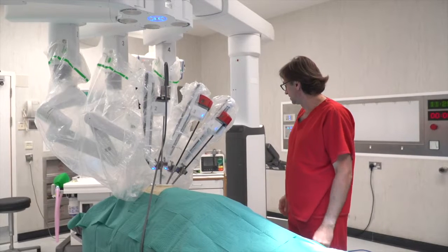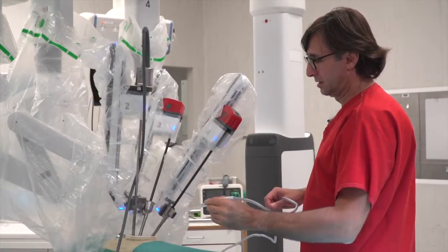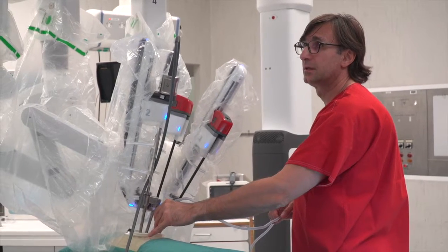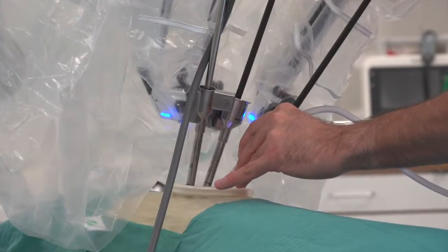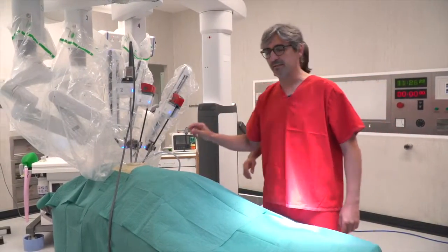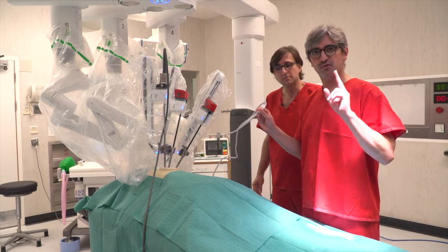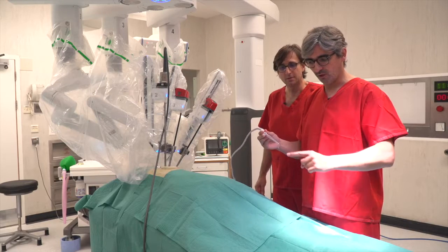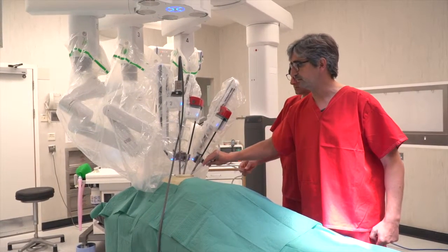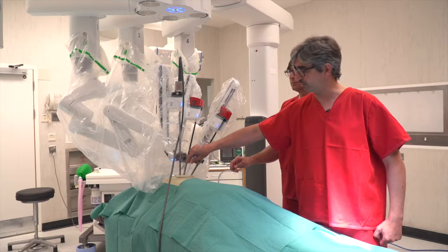Now I am ready — the console surgeon. Take the suction. The assistant with the suction will follow the surgeon. One important detail: it is very important that the assistant — in this case, Mugur — uses the suction. The instruments he uses are only two or three: a long curved metallic suction. He has to see the space to help, to expose — for example, retract the lung, suction, remove blood or liquid.